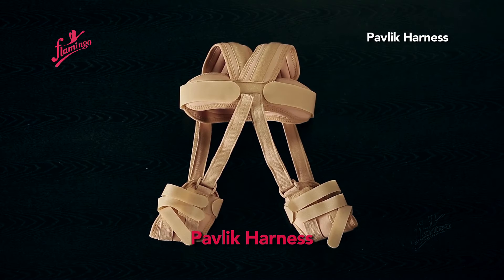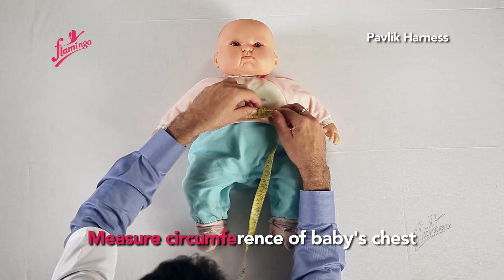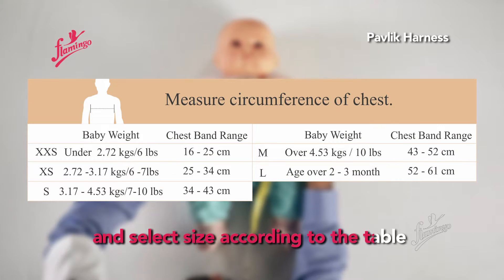Pavlik Harness. Measure the circumference of the baby's chest and select the appropriate size according to the sizing table.